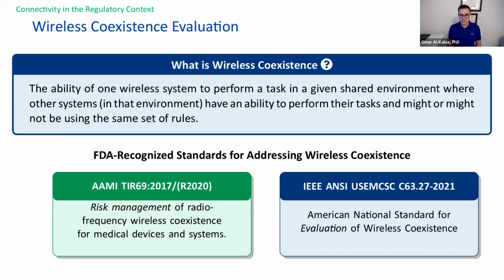Wireless coexistence is the ability of one wireless system, this can be your medical device, to perform a task, which is your device's intended function or wireless function, in a given shared environment, which is basically everywhere. Everywhere is a shared environment when it comes to wireless, where other systems in that environment have an ability to perform their tasks.